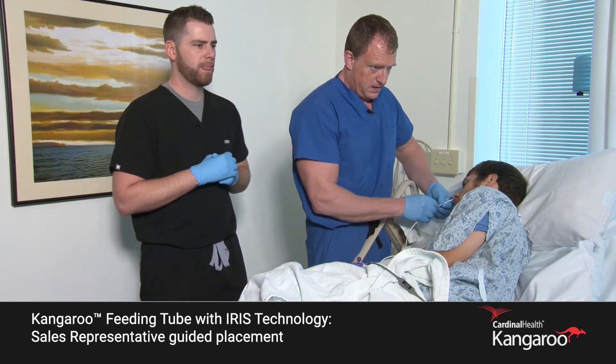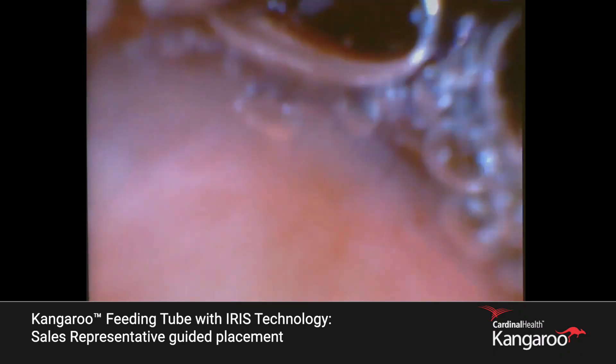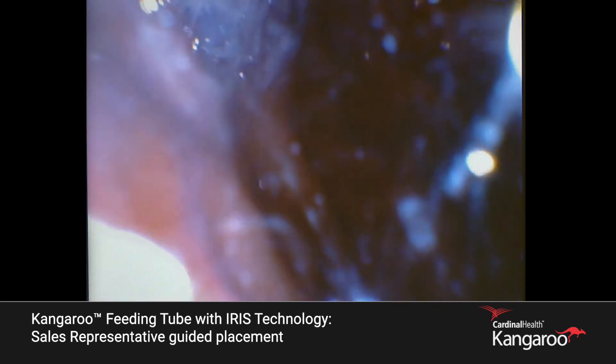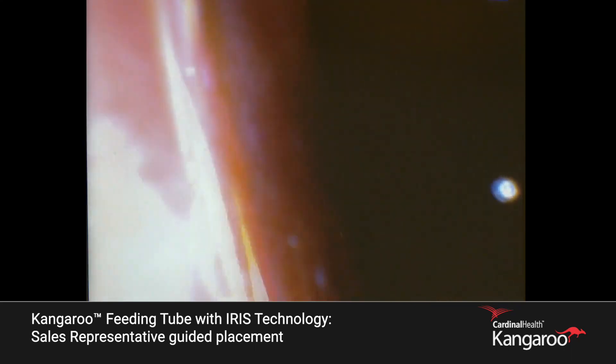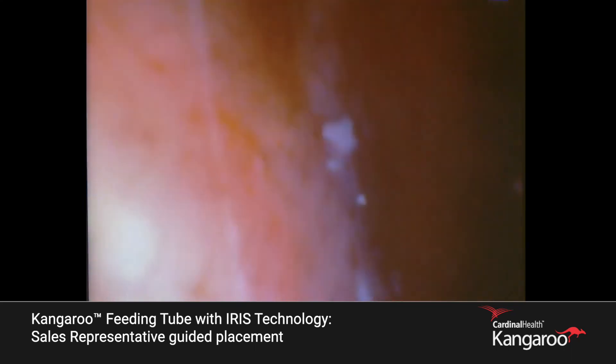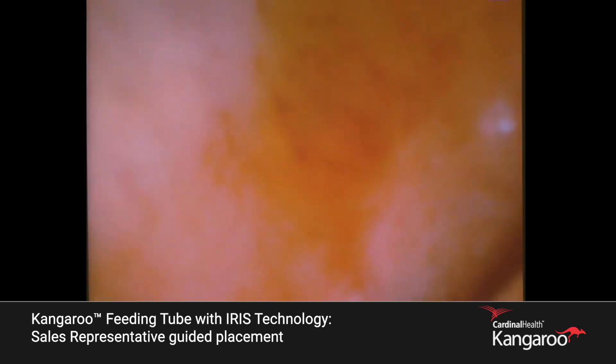We're back at 50 and we're at the fundus — top of the stomach. Let's ride the greater curvature. Great job, there's the rugal stomach. Let's slowly advance toward the antrum — just a centimeter at a time. All of a sudden it's going to pass through, and we'll look for rapid movement and that texture change we discussed.